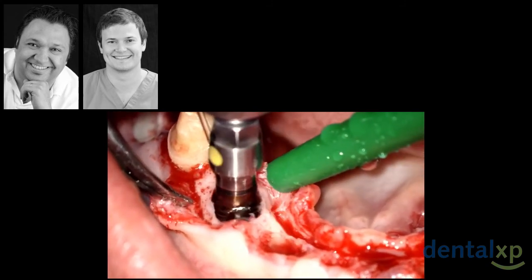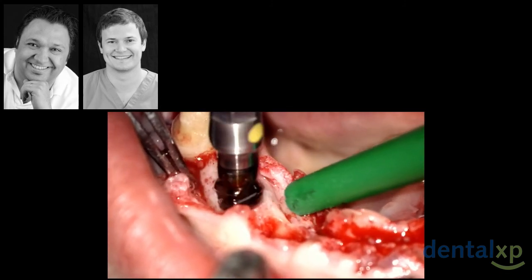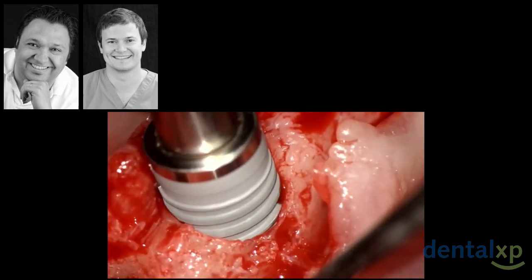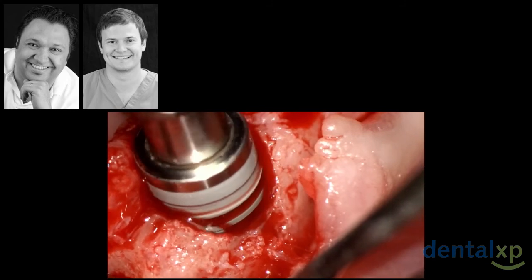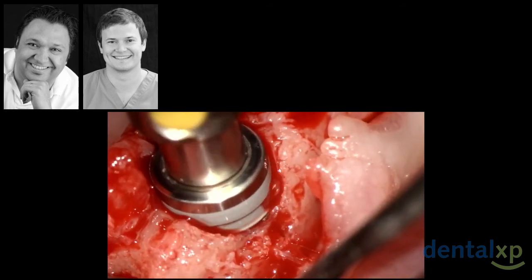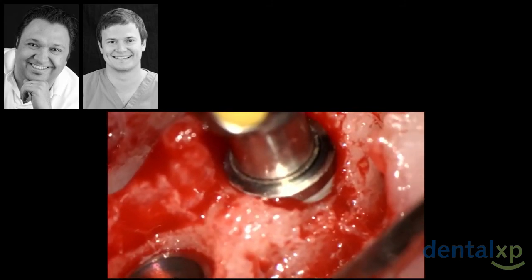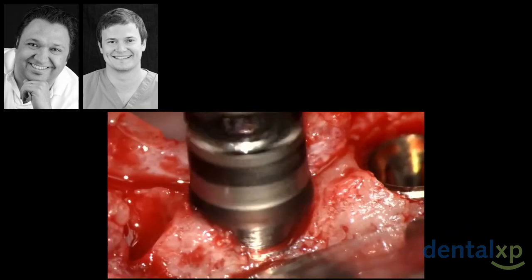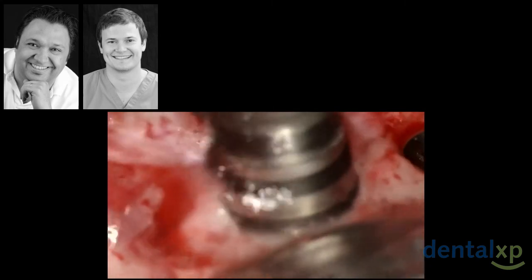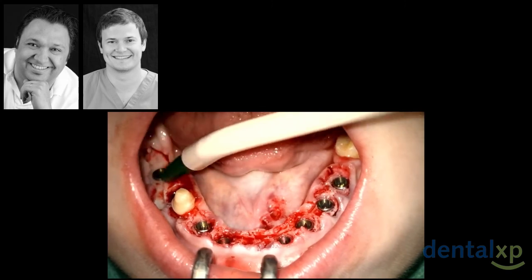Of course, guided surgery doesn't mean flapless surgery. That's a common mistake. For me, with conical connection implants, I think it's really important to assess and check where you're going to end up with your implant platform to reestablish a correct biology, especially in cases with thin biotype. You know that you can put your platform equicrestally or subcrestally, and that the bone remodeling depends a lot on implant position. Then we use a trephine to remove the bony interferences.